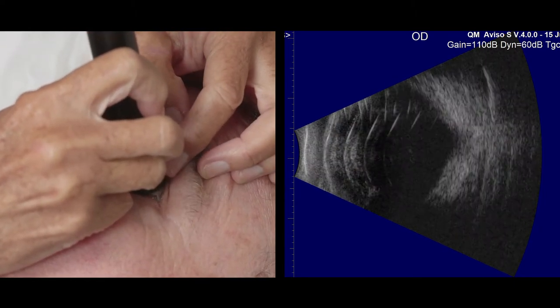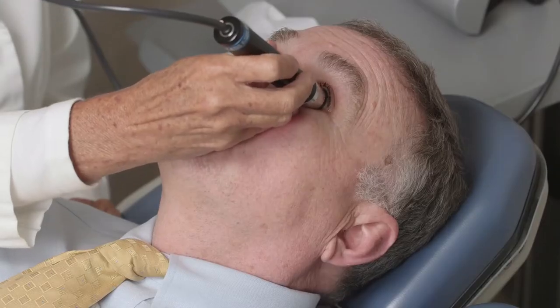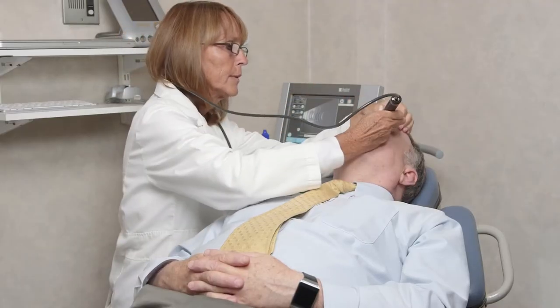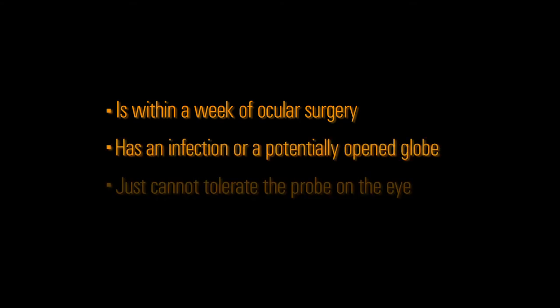Throughout the procedure, the examiner should be attentive to the patient's behavior. If the patient is wiggling, squeezing, or hanging onto the chair tightly, they may be uncomfortable. Although it's ideal to perform the exam on an opened eye, there are instances when performing it through the lids is recommended — if the patient is within a week of ocular surgery, has an infection, or a potentially opened globe, or if they just cannot tolerate the probe on the eye.